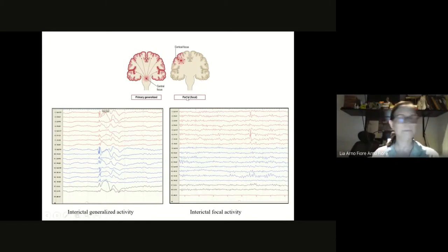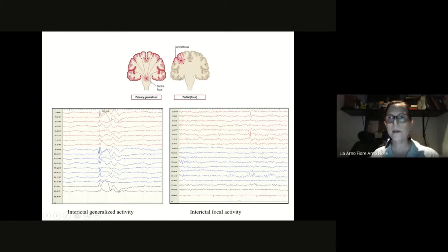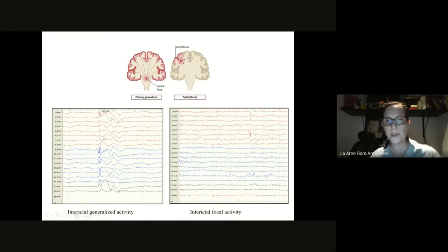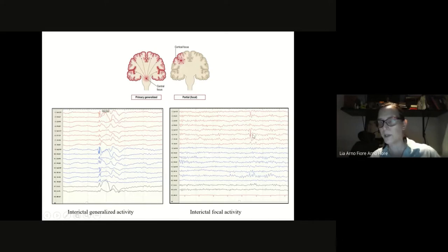Remembering from the first lesson: you have interictal activity, which is between seizures. It can be either generalized — involving the whole cortex — or focal, limited to one part only. In our EEG layout, red was the left side, blue was the right side, with the midline in between. When both sides show epileptiform activity — very pointy with a slow wave after it — this is generalized interictal activity. When only one side shows a spike with a phase reversal, that is focal interictal activity, in this case pointing to the temporal lobe going into the frontal.